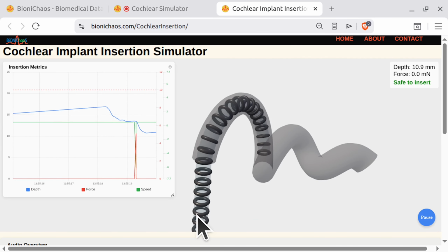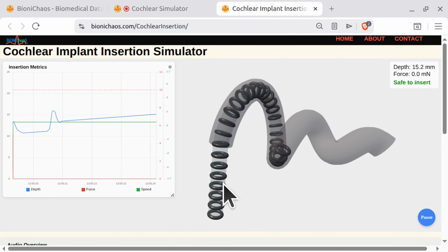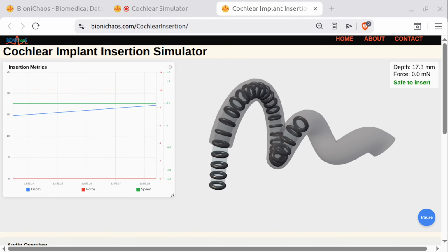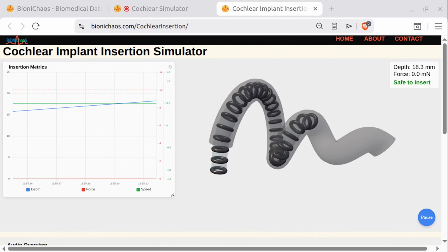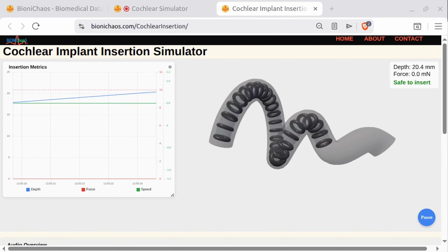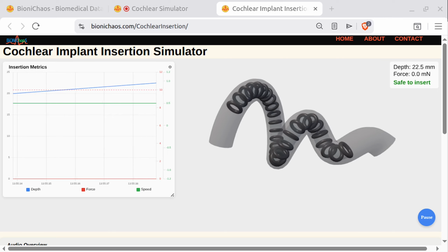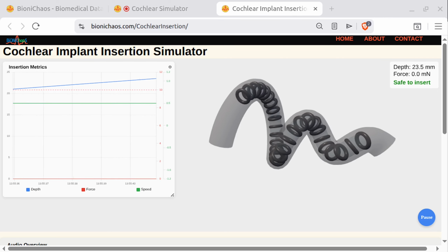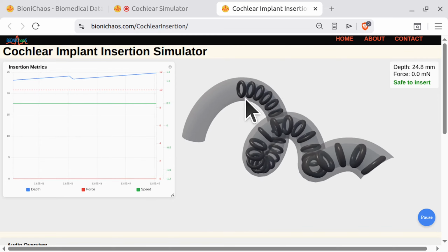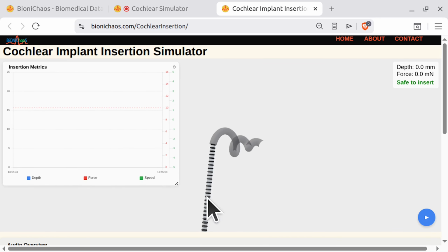Exactly, suspended in midair. And because it's just hanging there, exposed, it is frequently stretched, scraped, or even entirely sacrificed just to get the surgical drill close to the cochlea. Well, sacrificed makes it sound malicious, but yes, it can be injured. And when that nerve is injured, the patient wakes up with hypogeusia, a severe loss of taste, or worse, dysgeusia. Which is rare, but it happens. They aren't just experiencing a lack of flavor, right? They are experiencing constant metallic tastes or a burning, tingling sensation on their tongue every single time they try to eat.